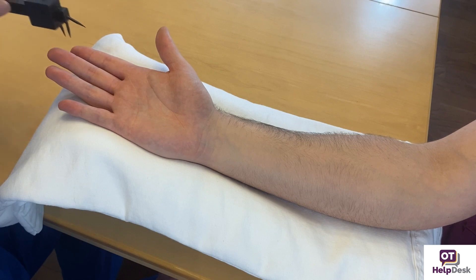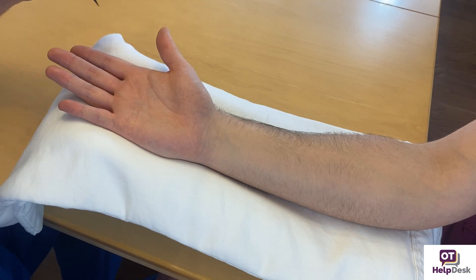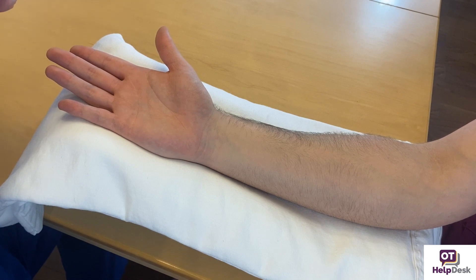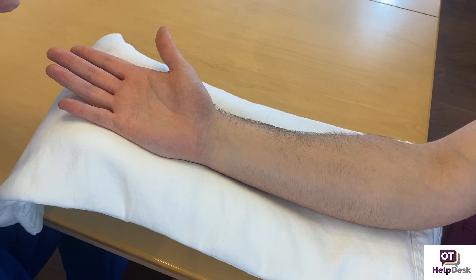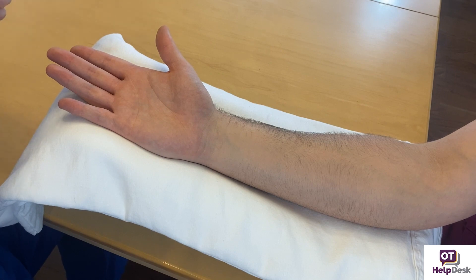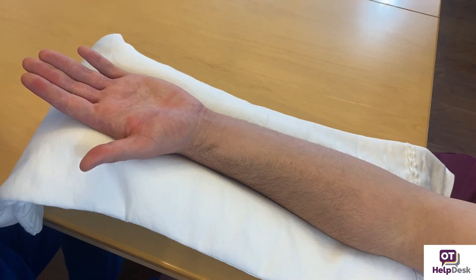Joseph feels two points consistently, which suggests he has two-point discrimination in his non-affected hand. He also now has an idea of how I'm going to test. Joseph, bring it over — Joseph has an ulnar nerve injury.